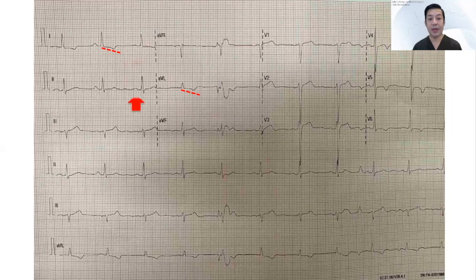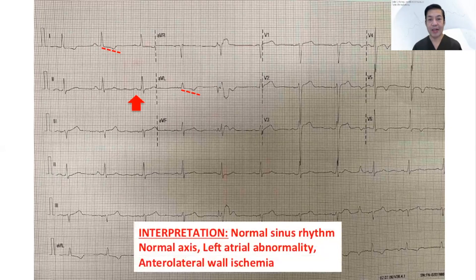If you look closely at lead 2, you can see a widened and notched P-wave. So the correct reading — after proper standardization and making sure that the leads are correctly placed — is actually normal sinus rhythm, normal axis, left atrial abnormality, and anterolateral wall ischemia.